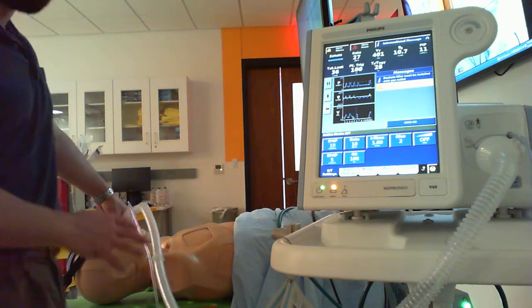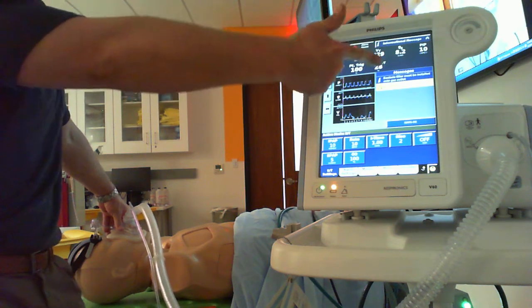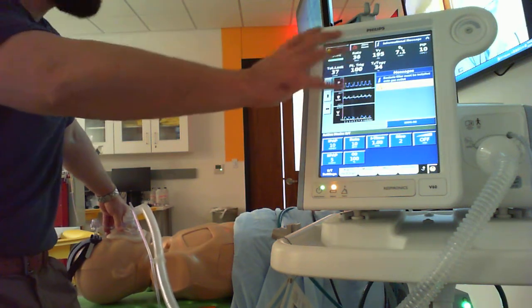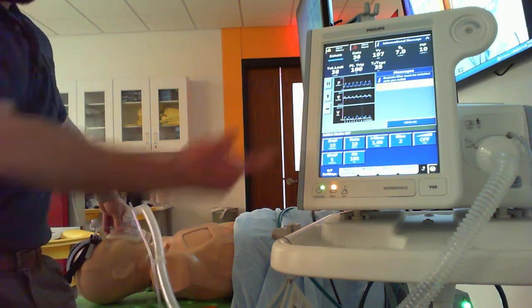Okay, you can see just me briefly letting my hand off the mask for a second. Our tidal volumes falsely elevated, and our respiratory rate dropped down. Okay, that's all inaccurate. You want to give yourself several moments to make sure values are stabilizing before you jump the gun.